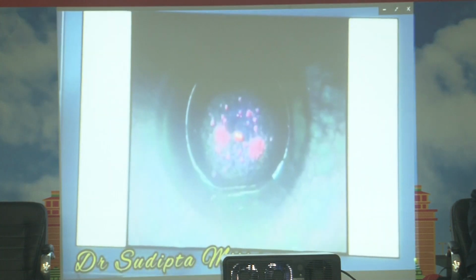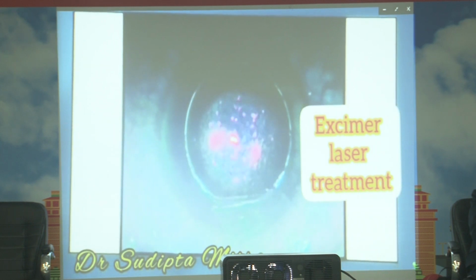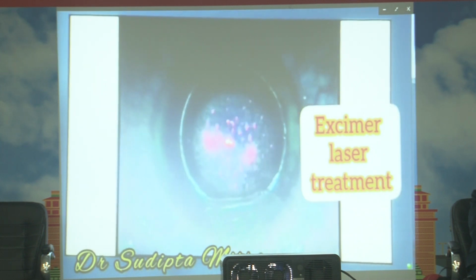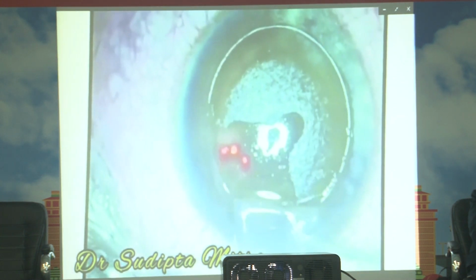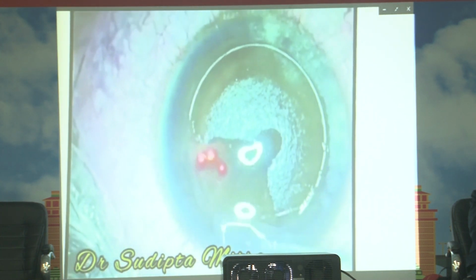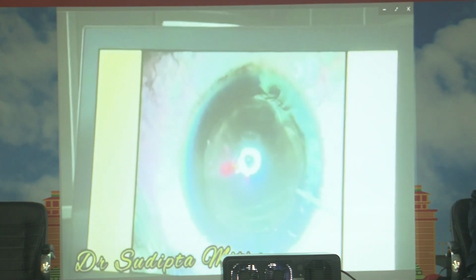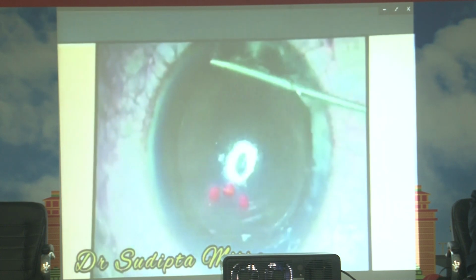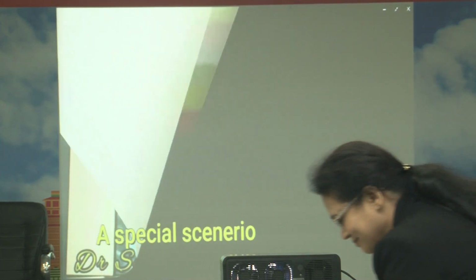This is the Zeiss refractive suite. You can femto out the flap and use the excimer laser to do the ablation and do as much correction as you feed into the machine. And the procedure is very neat and clean, and the patient usually recovers very well. Of course, you have to keep an eye on the ocular surface, as I said.